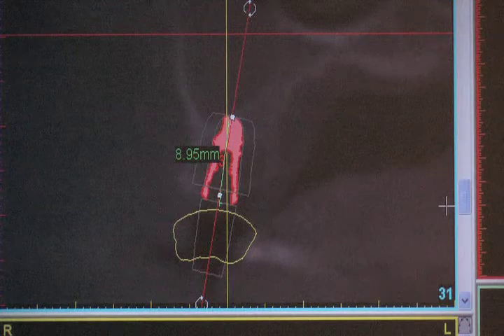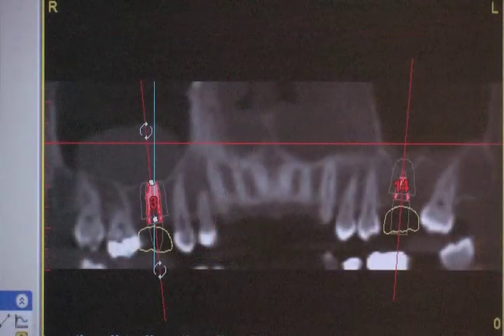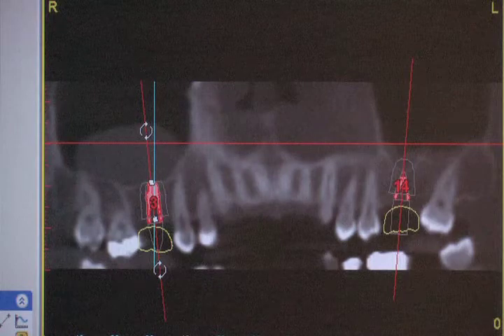for me. So rather than guessing or hoping that I can get an implant in the proper position, I'm going to know exactly, precisely where I want to place the implant, and if I'm able to indeed place the implant without doing more invasive procedures, such as a true sinus elevation or sinus augmentation.